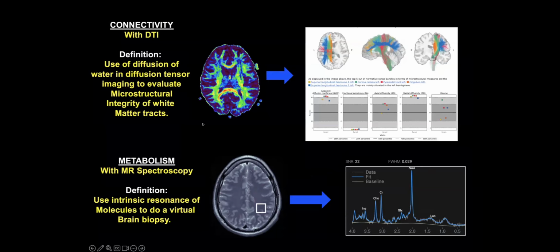You can actually take a feature of white matter microstructural integrity called the fractional anisotropy, or FA. There are other things you can measure as well, but we won't go into those so much because the FA is the most sensitive measure of microstructural abnormality in traumatic brain injury in particular. It describes the movement of water along white matter tracts. And so when that movement is impaired because the white matter tract is damaged, we can see abnormally low FA.